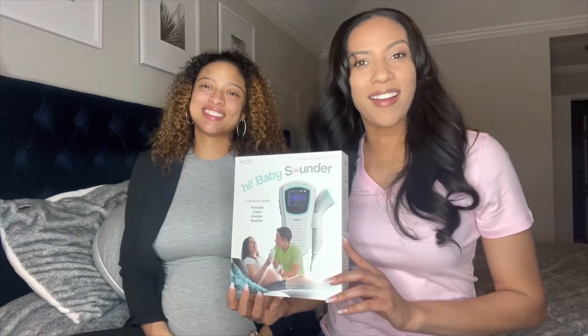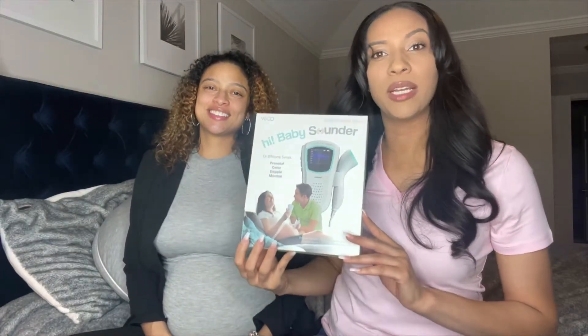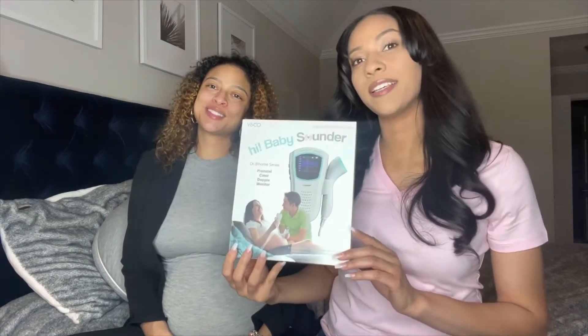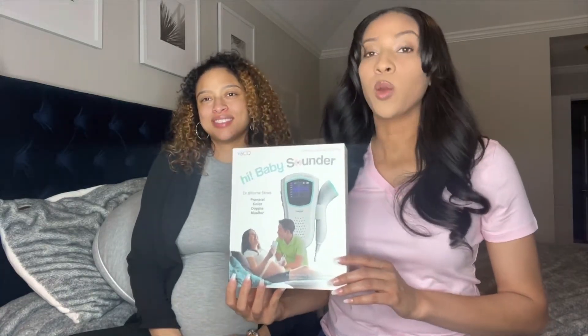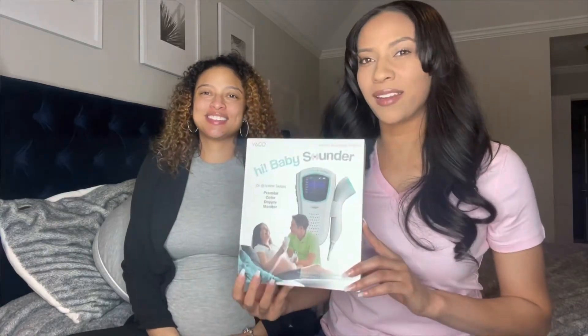We are so excited to get our hands on the Hi Baby Sounder Prenatal Color Doppler Monitor. It gives you the accuracy of a doctor's visit from the comfort of your own home. We're going to unbox it and show you how to use it.